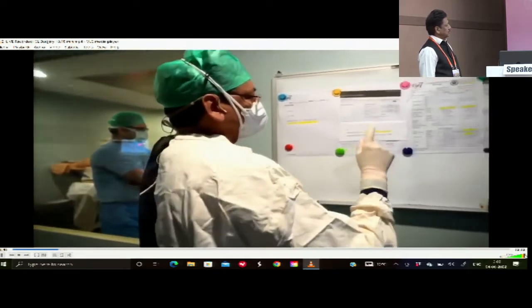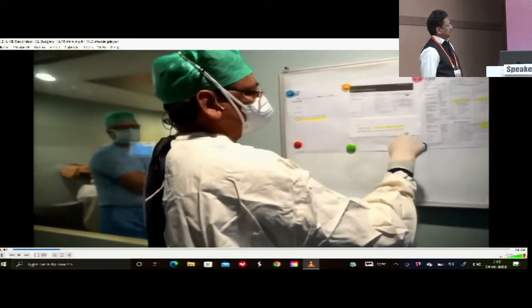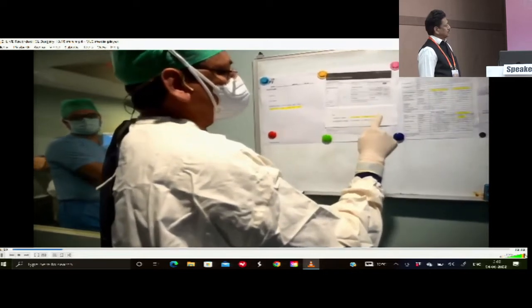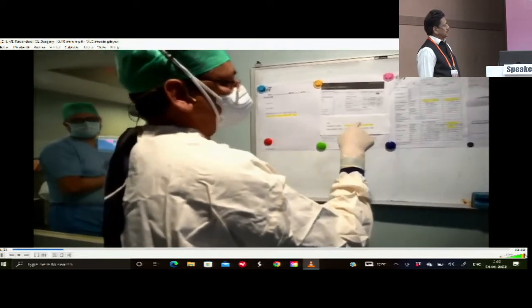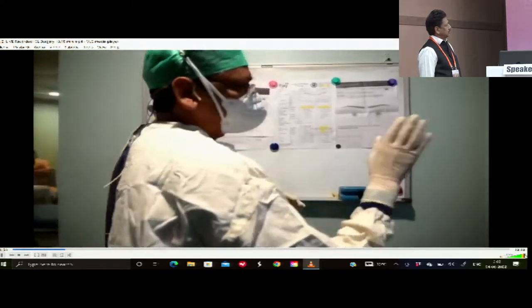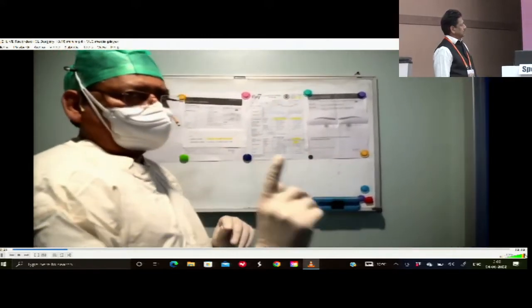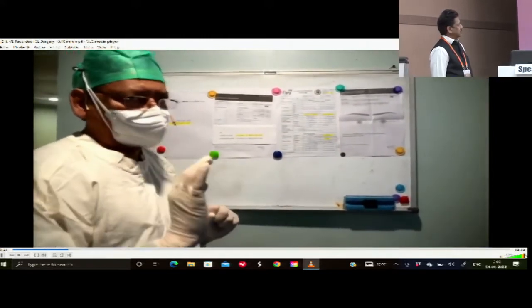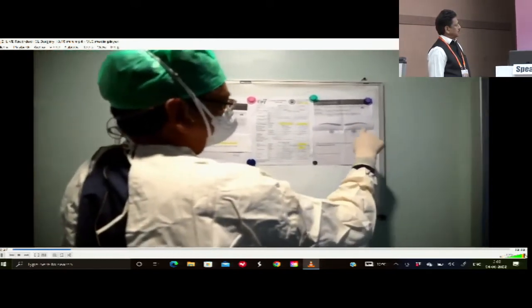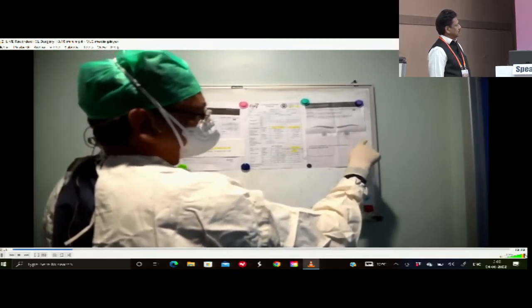Now, the axis is 85 and the lens has come at an axis of 90. So 90 has to be rotated to 85. Come to this last one. If 90 has to be rotated to 85, that means you have to rotate it through 5 degrees clockwise. So here is the chart which tells you that the lens has to be rotated clockwise through 5 degrees.